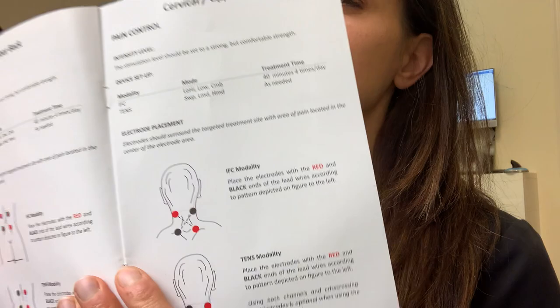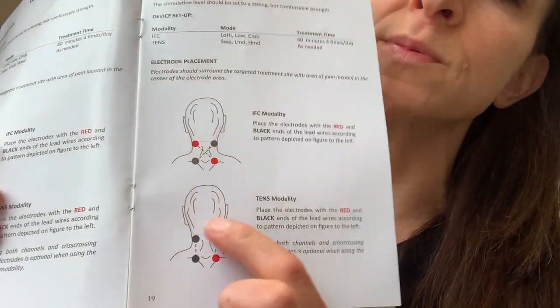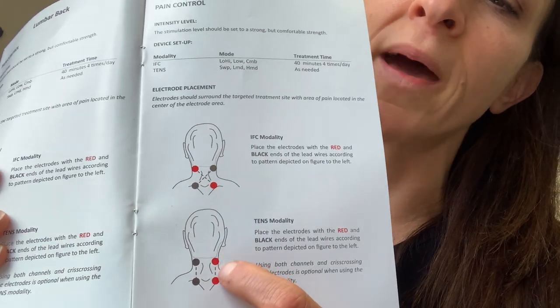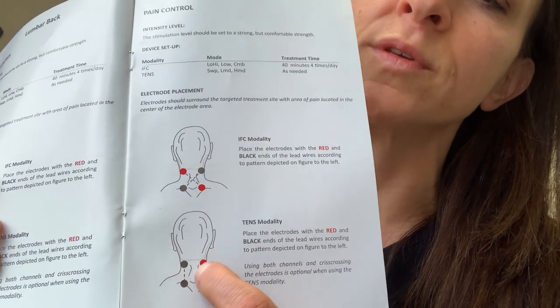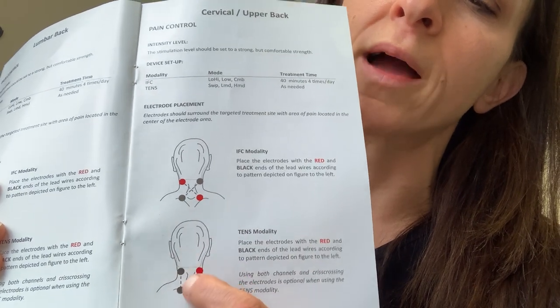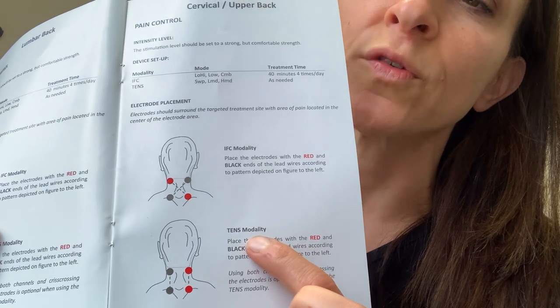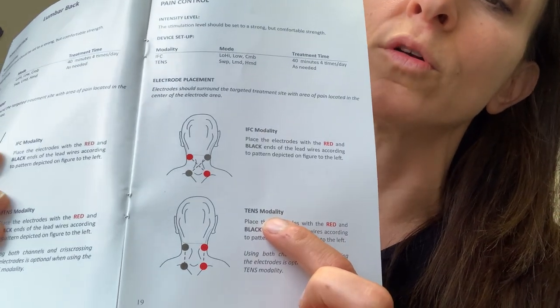In the rest of the book, it doesn't clearly show you the NMES placement, so you're going to follow the pad placements for the TENS modality. Notice the pads are parallel to the spine itself. For NMES, the red leads would be on one side of your body and the black leads would be on the other side.